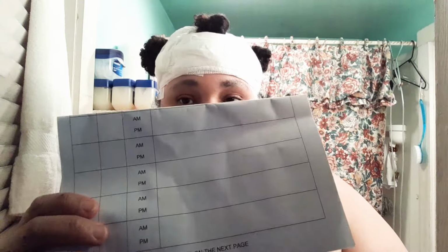What it does is, normally it would test for a seizure. There's a button on this thing that you would push, and then you would get this piece of paper. It's flipped like this because I don't want to show my information. Basically, you would write down the date, the time, circle AM or PM, and then write in as much detail as you can remember of what happened and what was going on during that time. This gives the doctor more information about what's going on with your brain while you're sleeping, or if you're awake, because seizures can happen anytime.